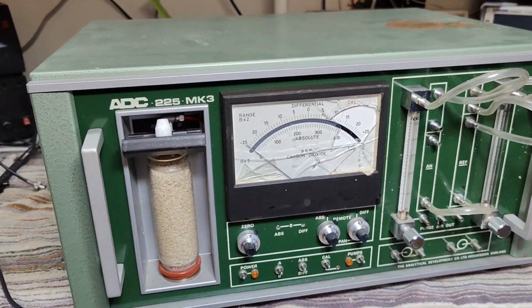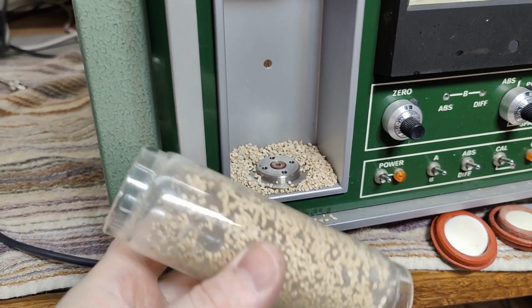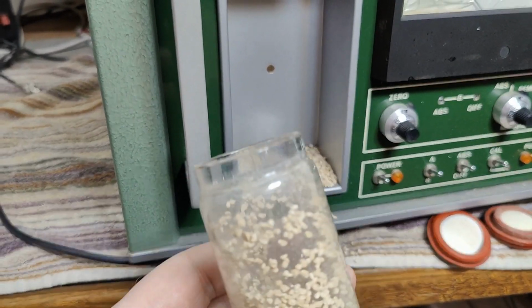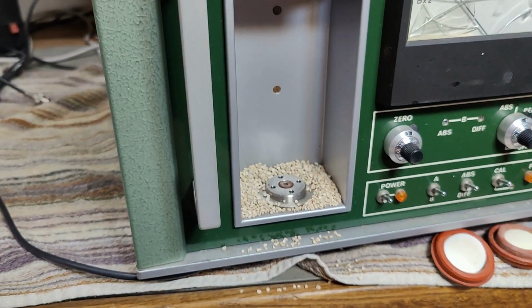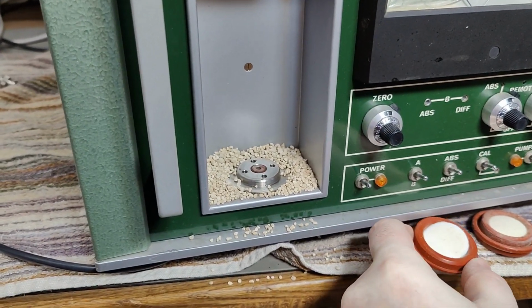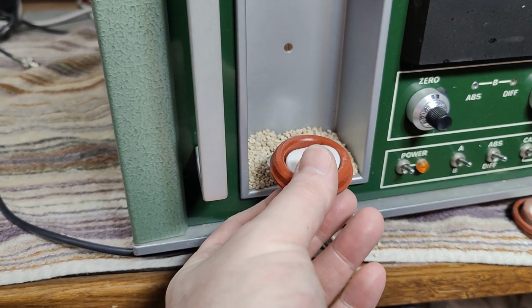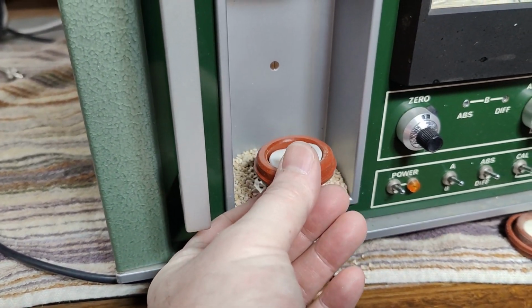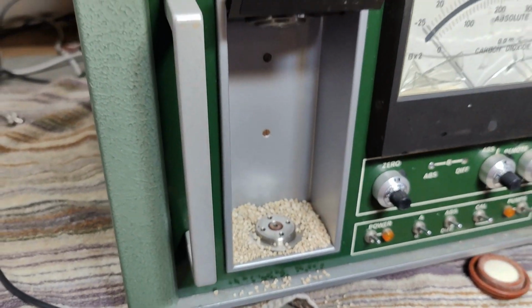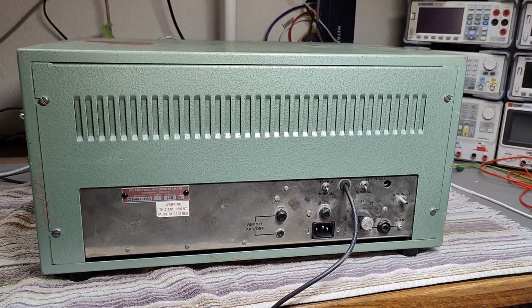This one I want to remove and clean this up. And then we can have a little look at the rear panel. And this is exactly what I did not want to happen. See, now I got all this mess all over the place. And it turns out I think I did it wrong. You're supposed to pull up and then take it out and hold these filter container plastic rubber thingies here. So you pull this out as well, and then, well, maybe that is what you need to do. It's so tough to poke around with this unit.